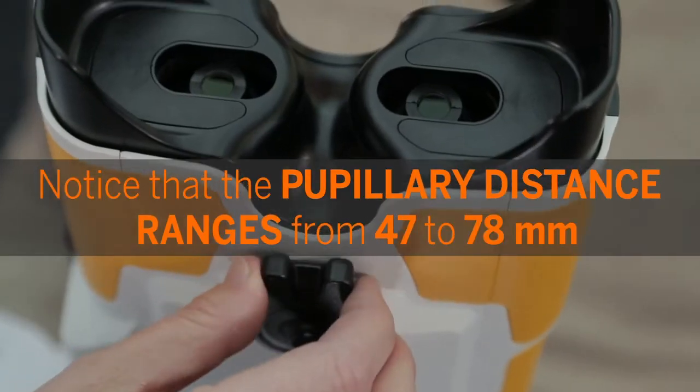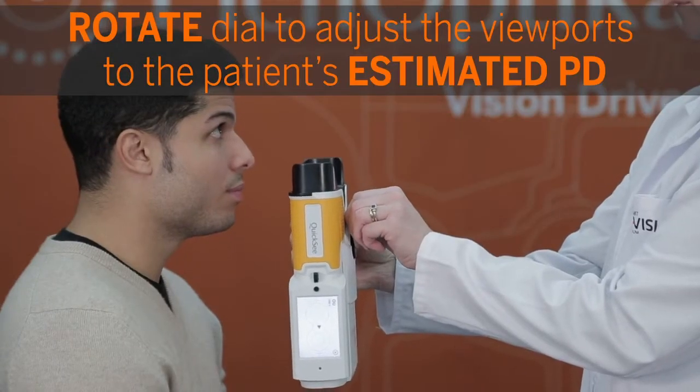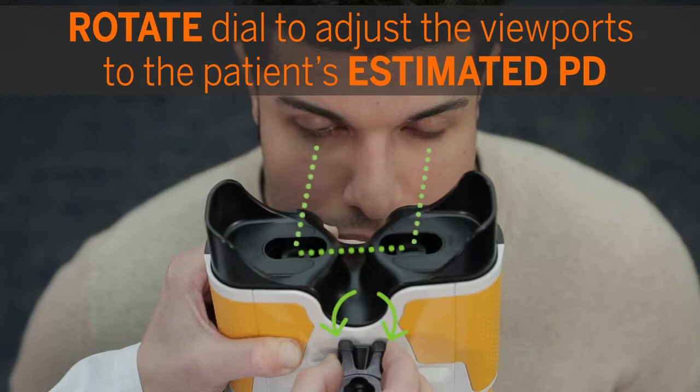Notice that the pupillary distance ranges from 47 to 78 millimeters. Rotate the dial to adjust the viewports to the patient's estimated PD.